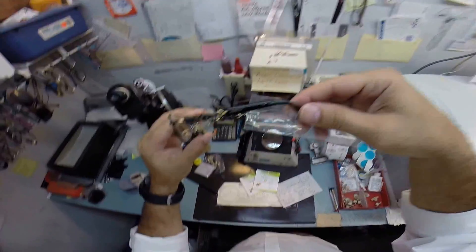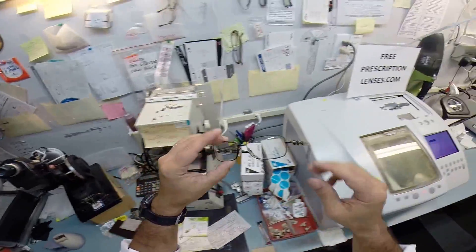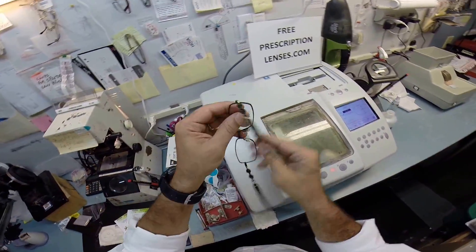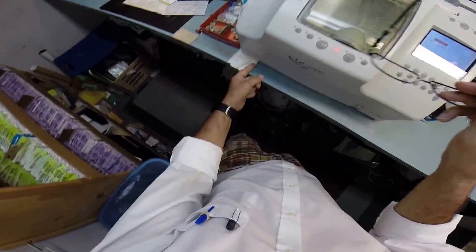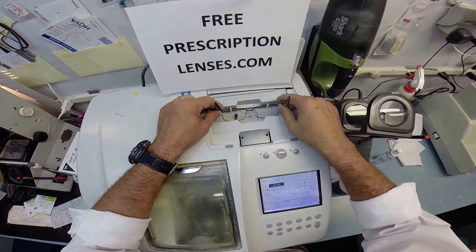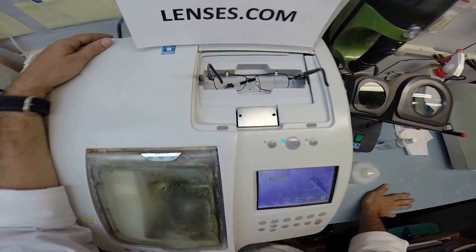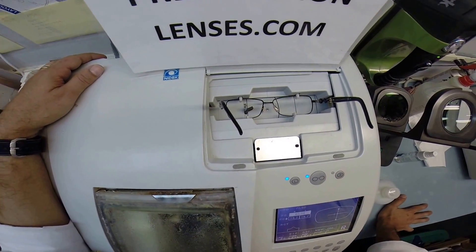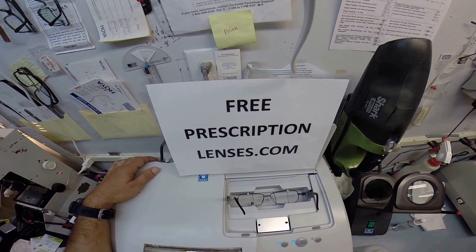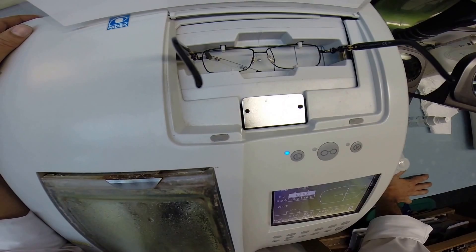This little plastic sleeve comes on the temple during shipping. I'm going to take that off and I'm going to take out the original demo lenses and put your Italian frame into my Italian Santinelli. This is the LE1000 patternless edger and I'm going to trace the shape of your left lens and then it's going to move over and trace the shape of the right.